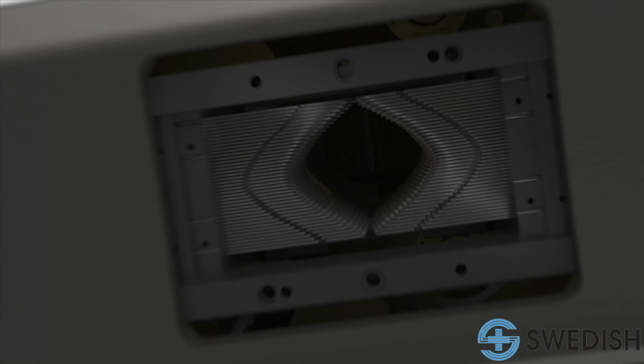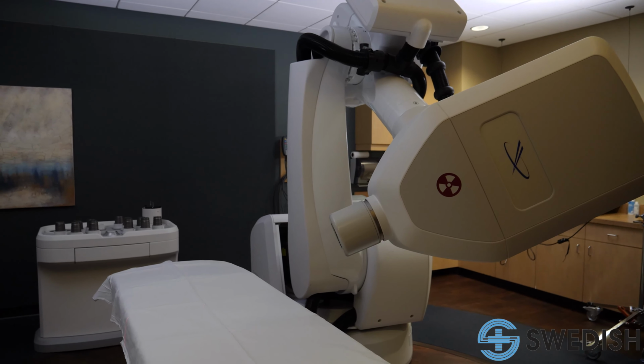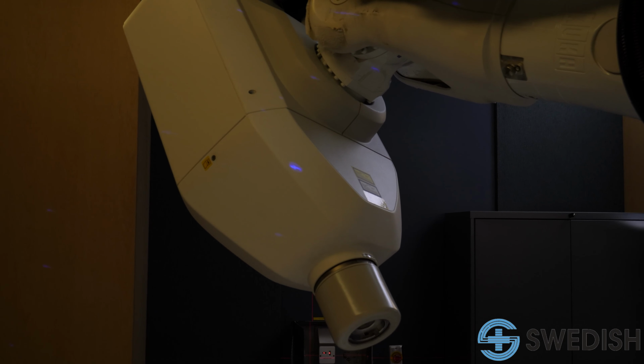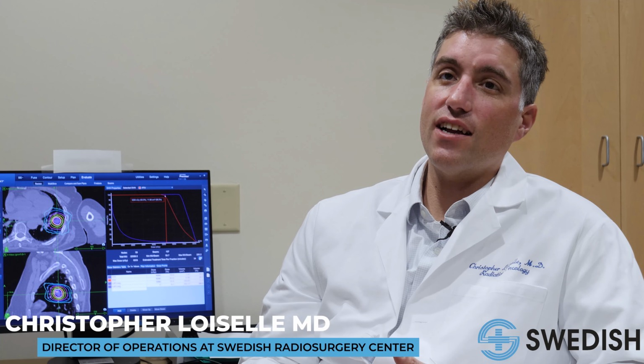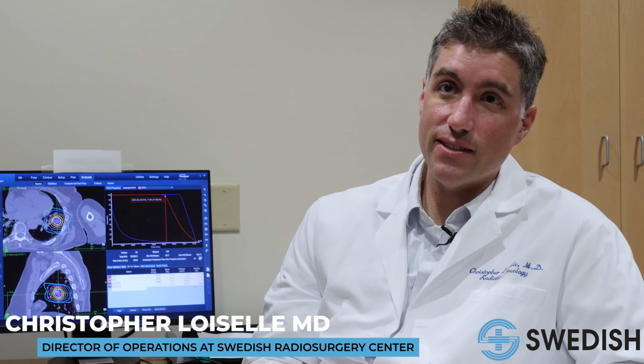The device treats from a spherical geometry using an articulated robotic arm. It treats from 100 or 120 different points from a sphere. This machine, because of its precision, can track motion with at least 1/12 of an inch accuracy. It is a 5-day treatment course. It's shockingly quick to go through this week of treatment.